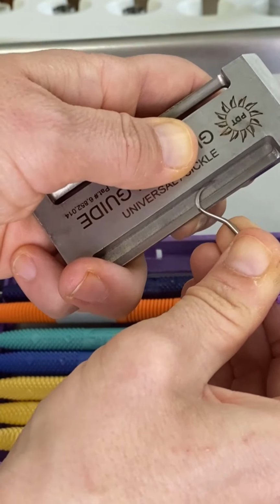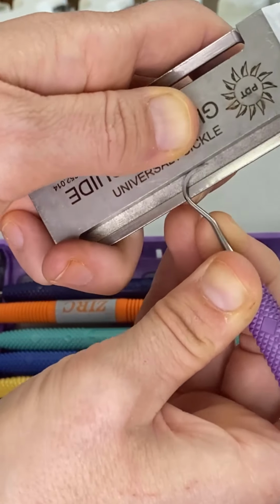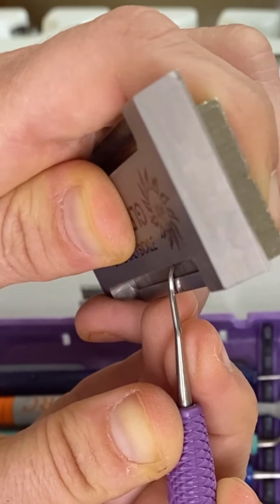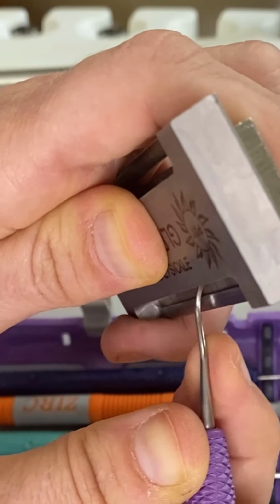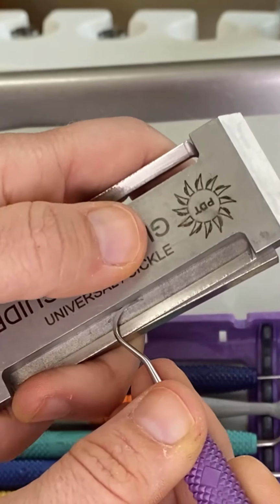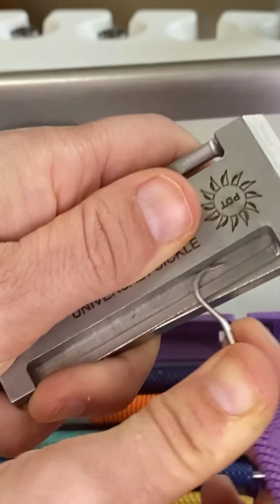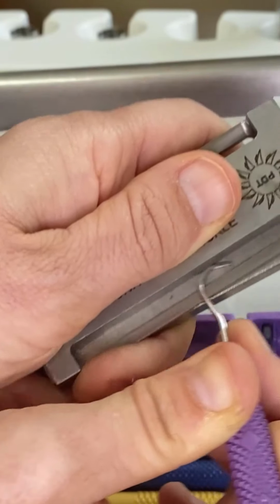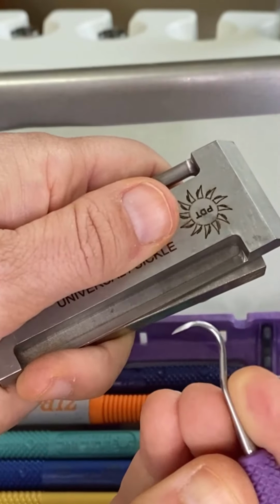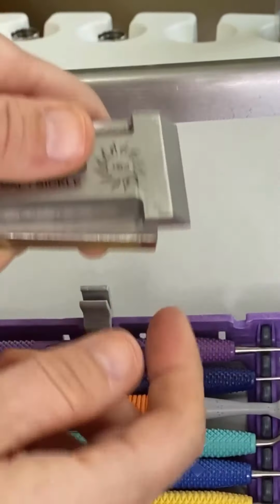I definitely start out slow because I really want to make sure that you're always on the stone. What will happen is you'll lift up from the actual stone, and I see a lot of this where they lift up and do it like this. Obviously I can hear it on the stone, but that's not going to give me a really good edge. So make sure you've got all 3 points before you start moving. Sometimes you can do that pendulum swing as you're moving. That definitely takes a little bit of practice too. If you're used to hand sharpening, this is a different beast, but keep trying, it'll come.